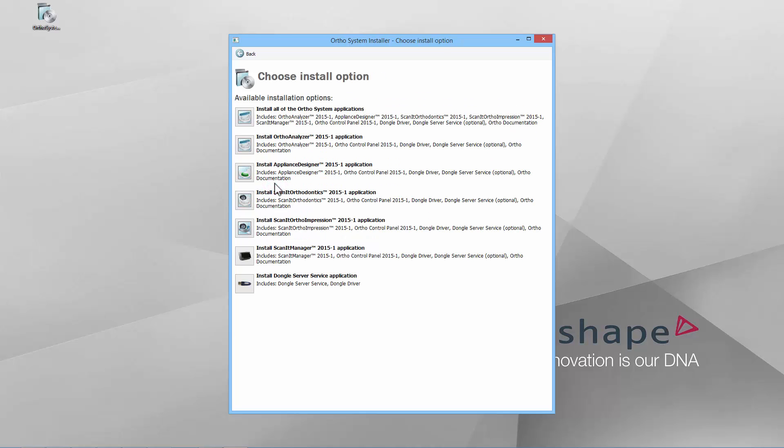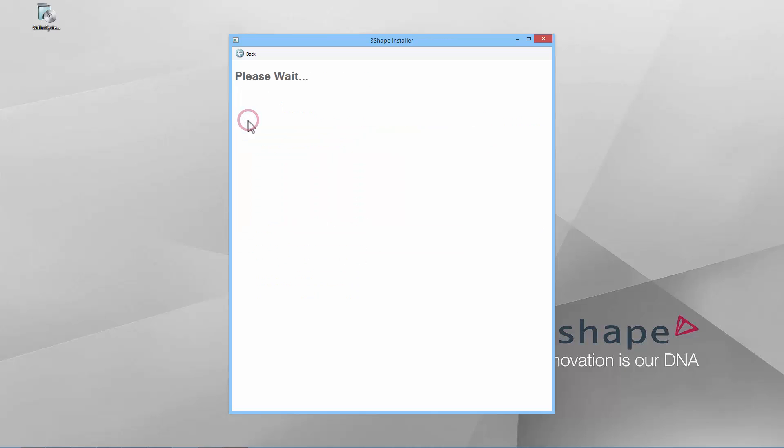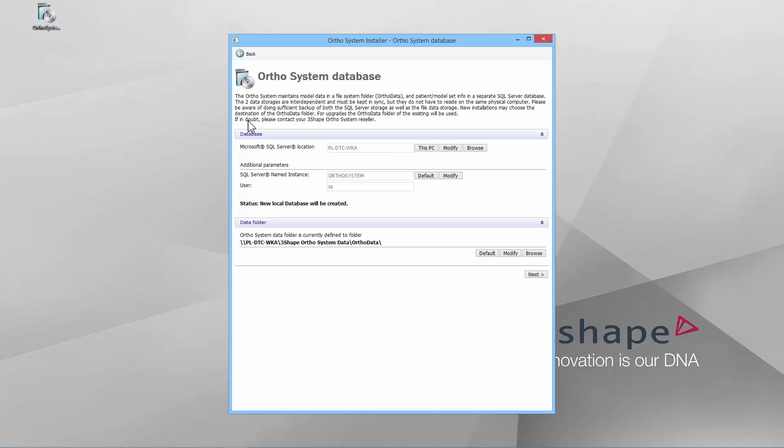Now you must choose the installation option. You may install all applications or just one of them. Click the icon corresponding to the chosen options. In this step, the OrthoDatabase will be created and the path to OrthoData will be set.